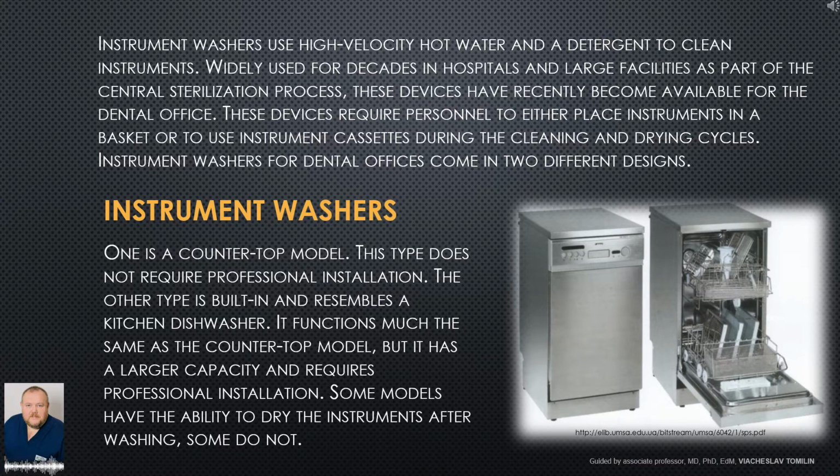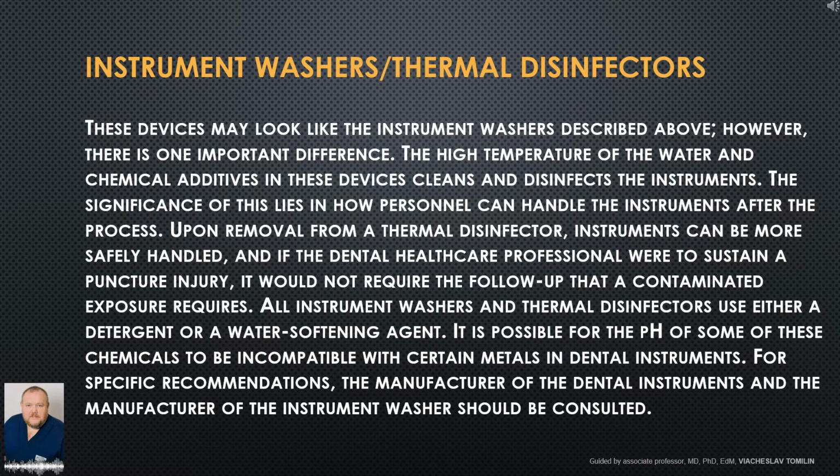One is a countertop model. This type does not require professional installation. The other type is built-in and resembles a kitchen dishwasher. It functions much the same as the countertop model, but it has a larger capacity and requires professional installation. Some models have the ability to dry the instruments after washing, some do not.